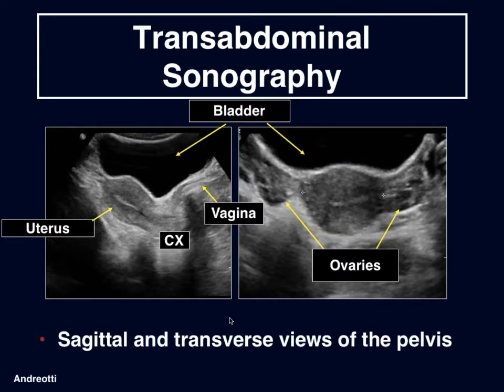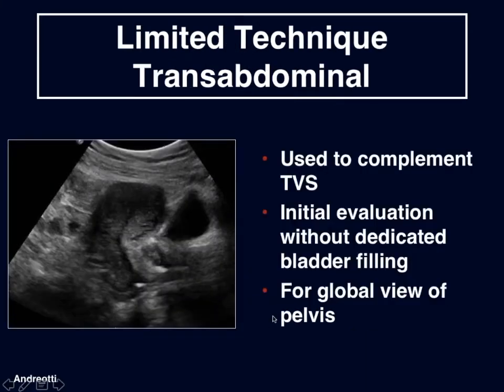Here we have our typical transabdominal image showing the distended bladder with the uterus behind the bladder. In our transverse image, once again the uterus, and we can see the ovaries on either side of the uterus. A limited transabdominal technique may also be used to complement transvaginal sonography — an initial evaluation without dedicated bladder filling, which has been found very useful to see a global view of the pelvis before performing a more detailed transvaginal examination.